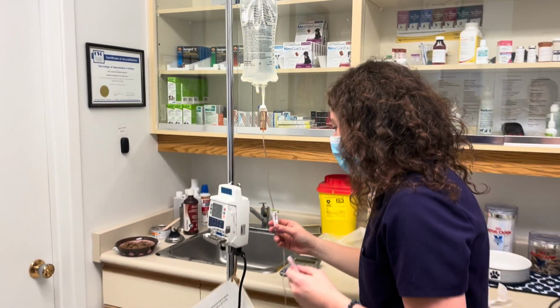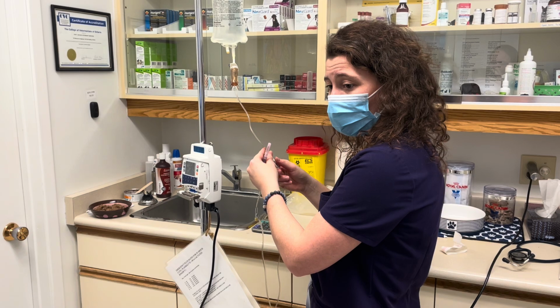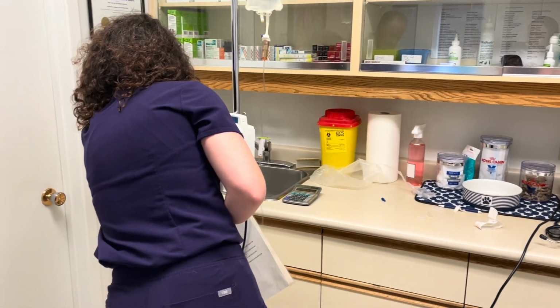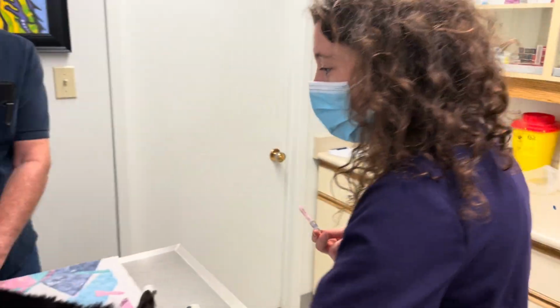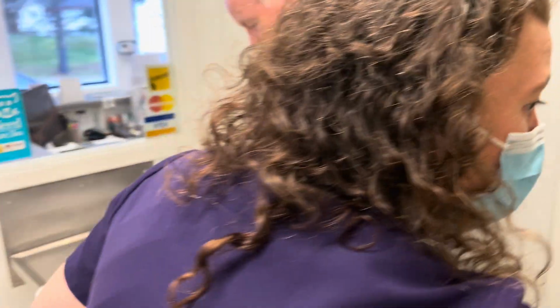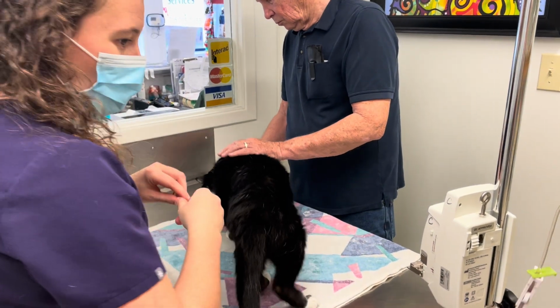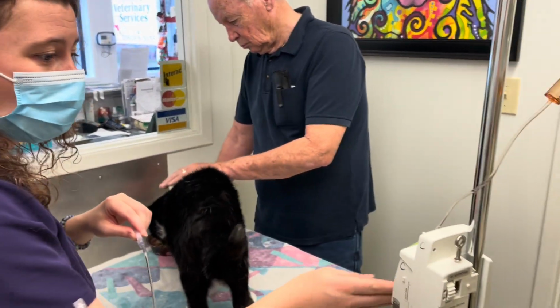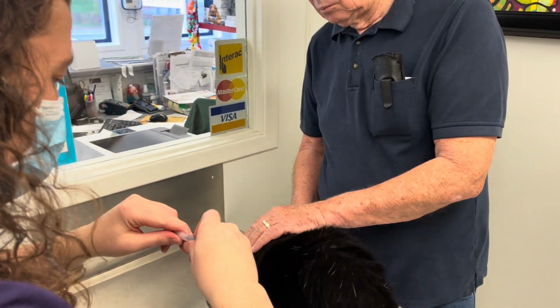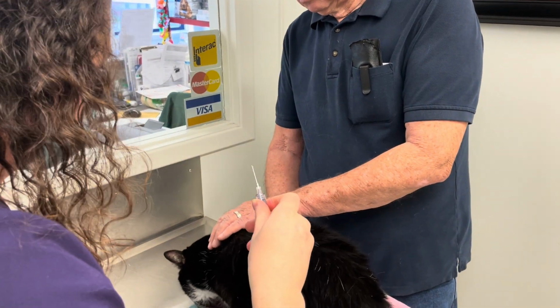So again, I want to start this, and then we're going to inject this into Oreo. So I want to give him his food. So we're going to put his food there. And we're going to do this in a very fear-free way. So I'm going to come over here. Oreo is going to get a really nice snack. And I'm going to take my needle here. Put this to the side.